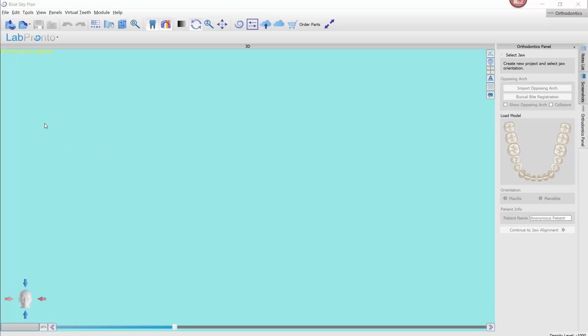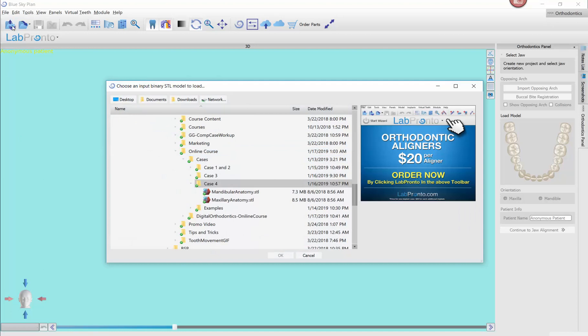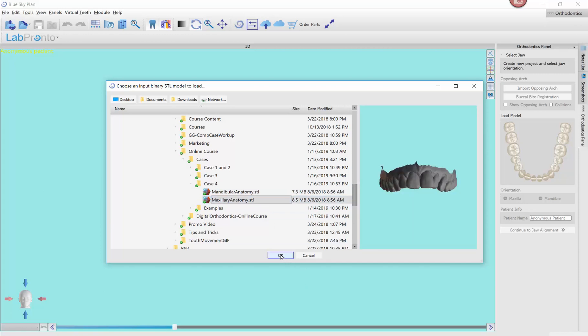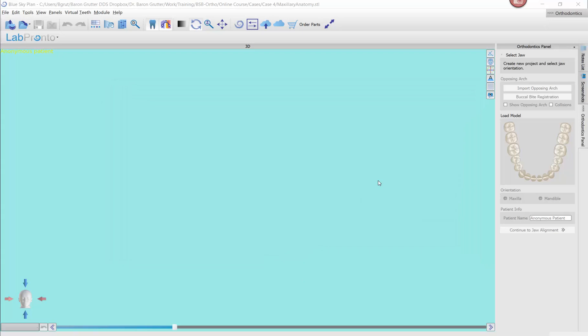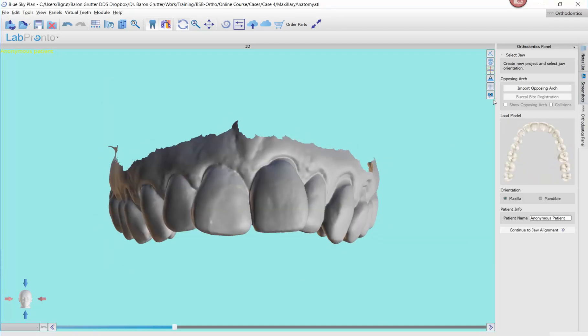Let me show you how this works. You've already seen the step of opening a case, but I'll repeat it. We've clicked on New Project. We're going to go ahead and click on the maxillary arch first. Bring in the maxilla first, then bring in the opposing.